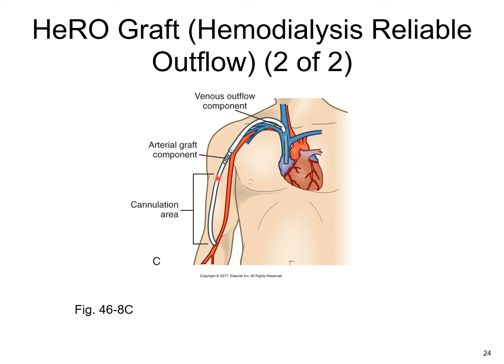This is their piece. They've connected this to the artery here, and then they've taken this directly to the heart, right? Maybe there was a problem with the vein itself. So this is what they've decided to do here. Once again, just know that this one's out there.